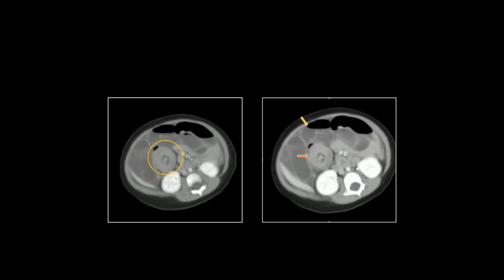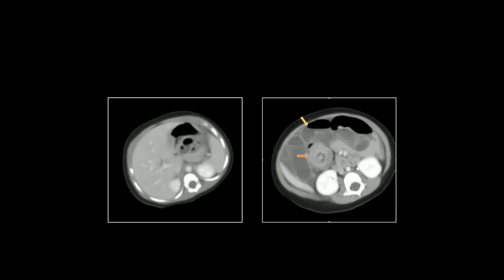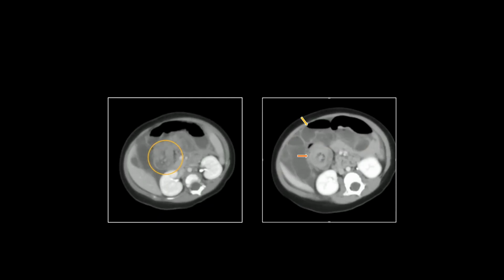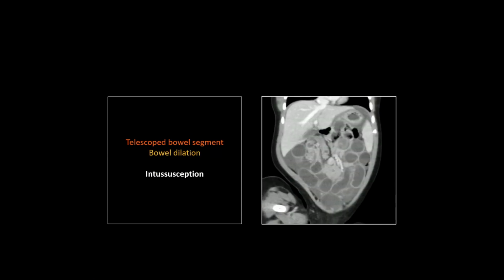So there it is there. Vessels and mesenteric fat are your indicators that we've got a bowel loop intussusception. So there it is here, and actually there's another shot on the coronal that's really nice right there. And of course, remember these go in the direction of peristalsis, and you have an intussusceptum, which is what is intussuscepted, into the intussusceptiens, which is the receiving portion of bowel.